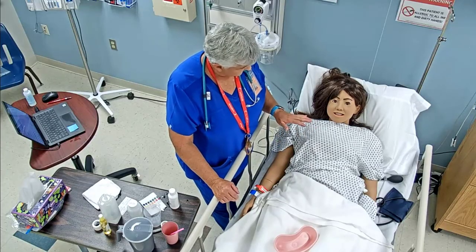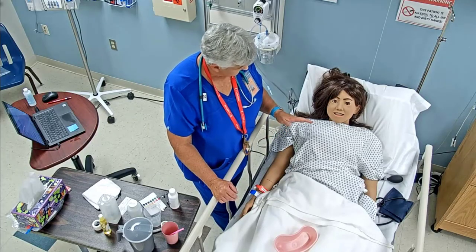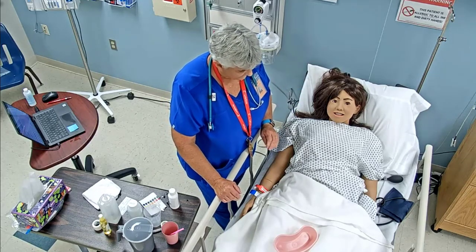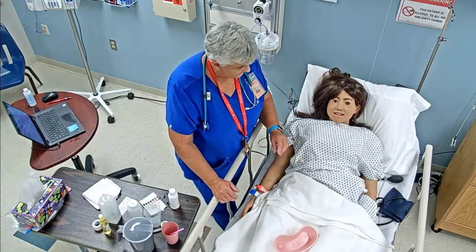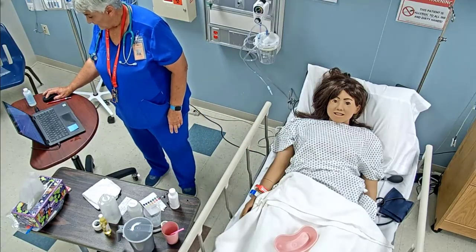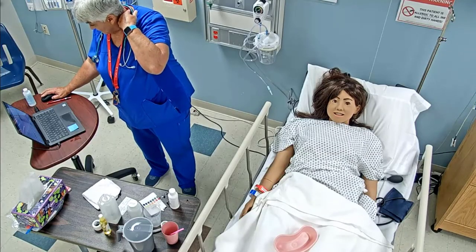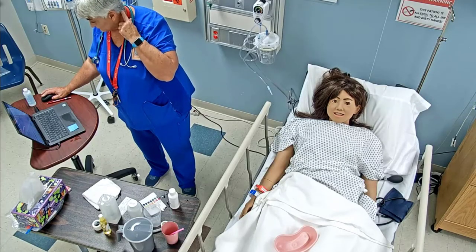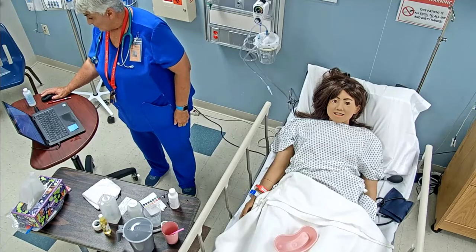Now, are you in any pain right now on a scale of 0 to 10, 0 being no pain, 10 being the most? You're not in any kind of pain right now? Okay, good. And so we want to make sure we keep your bed elevated just for a little bit right now. Anything that was unusual, our abdominal assessment, that we removed that. If you had any problems with, looking at my documentation here, to see if we have anything else that we need to report.